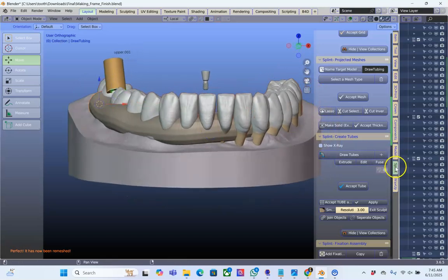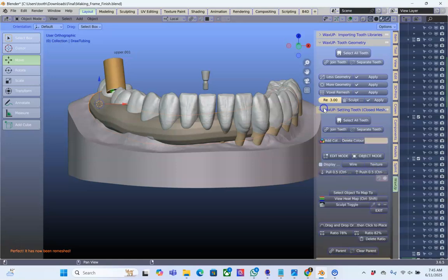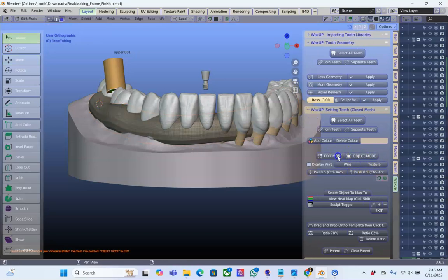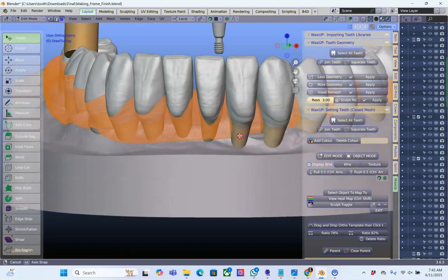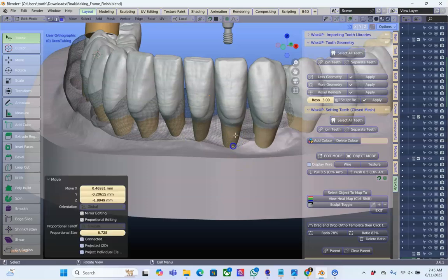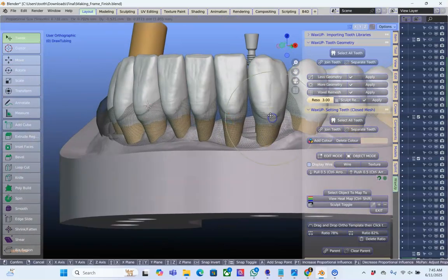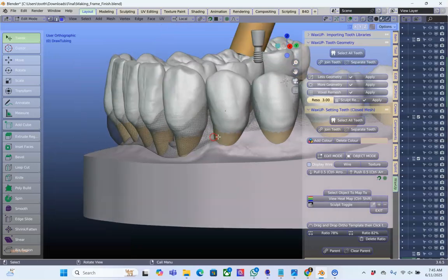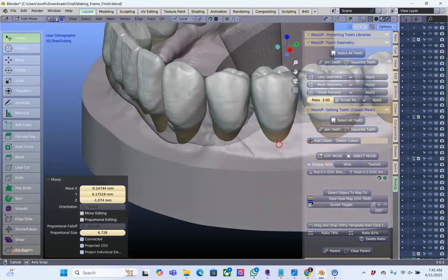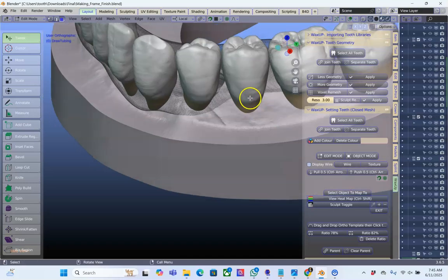Now I'm going to go to the wax up module and we're going to edit this. So over here, select it and go into edit and I'll go wireframe. Now this gives me a good easy way of doing it. Use the G key and then just grab and structure this correctly. And we do this before we do the wax up of it, the actual sculpting and so on. But for this video I'm not going to go into too much detail. You can do this yourself.